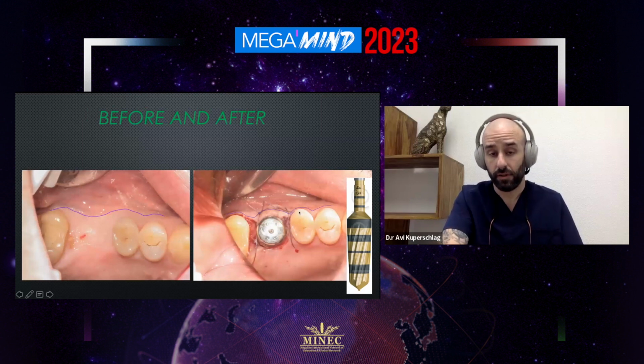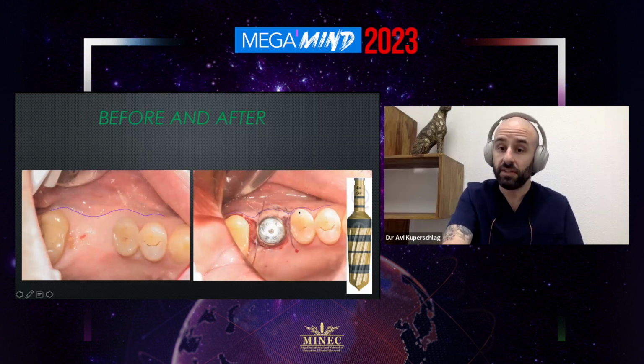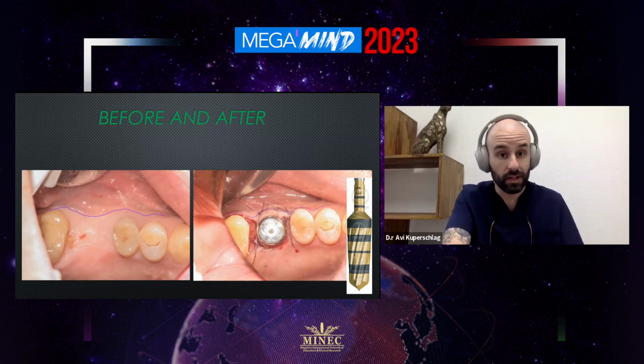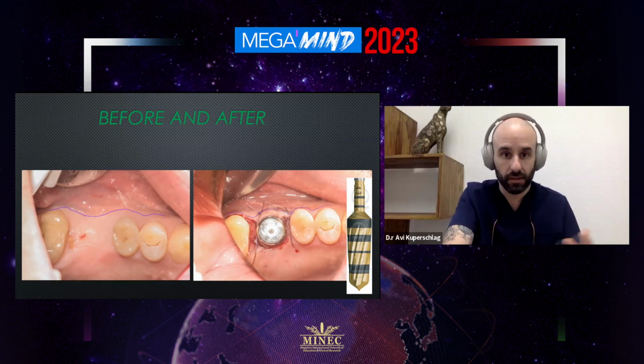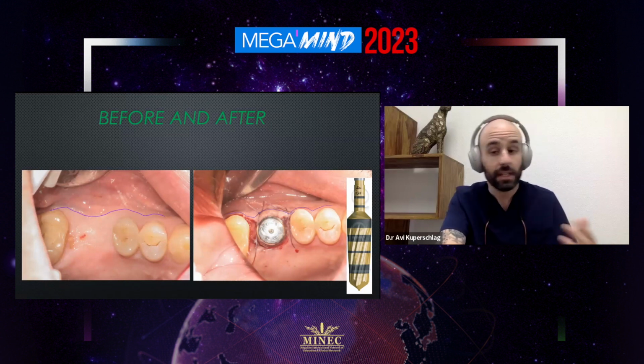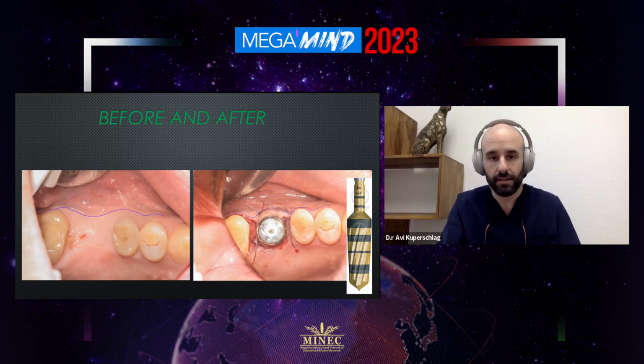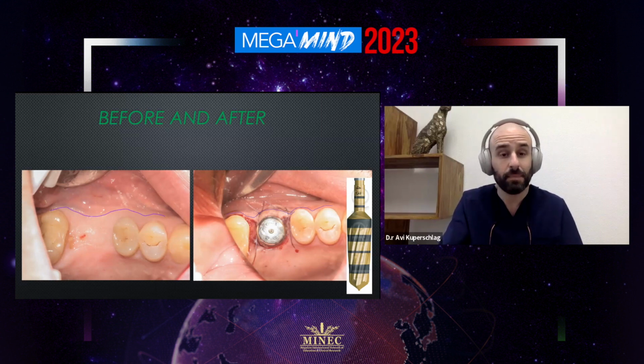Before and after. And now what I say to the patient, first of all, I hope that he will appreciate the hard work and the way that I avoided the lateral approach, because lateral approach we still do. I mean, it's not a religion. It has its pluses, it has its minuses. Mostly the minuses are for the patient.